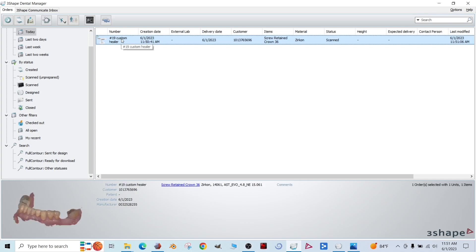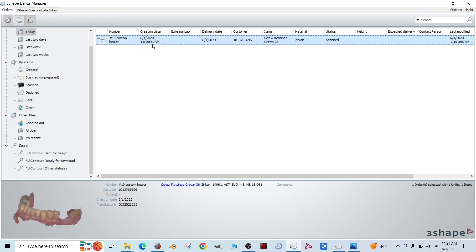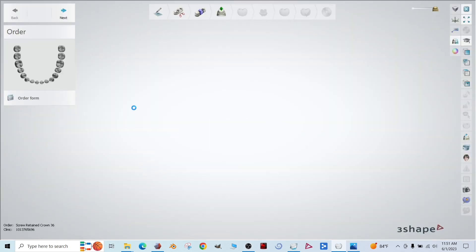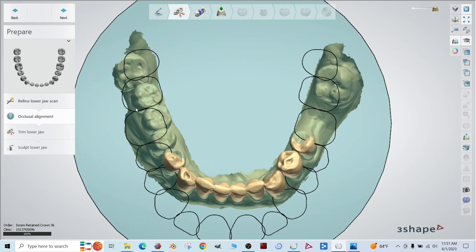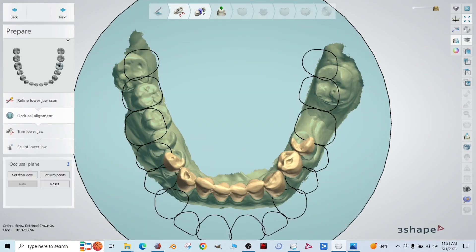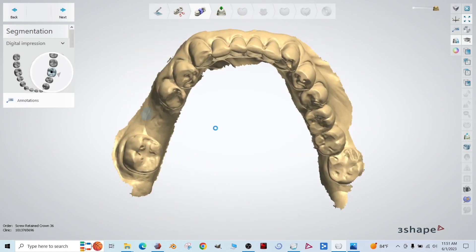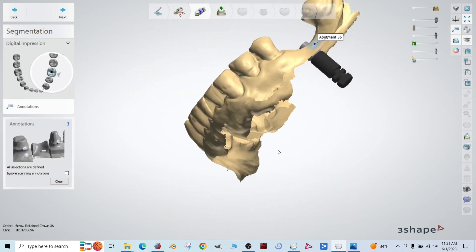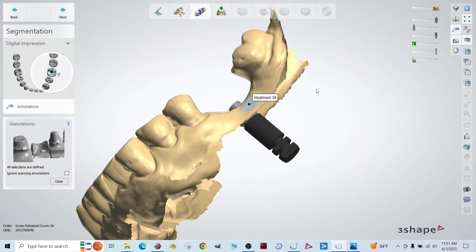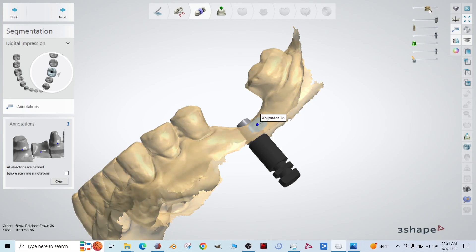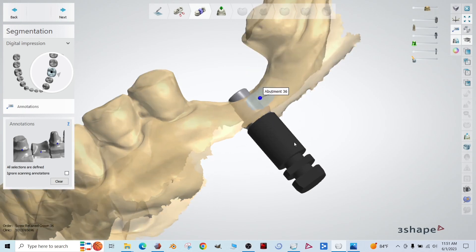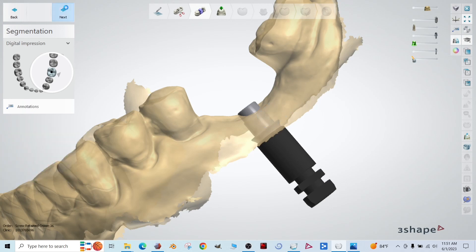This is asking for the abutment alignment scan. We're just going to select the same scan. All right. Right click. Click design. And we're just going to skip ahead to segmentation.